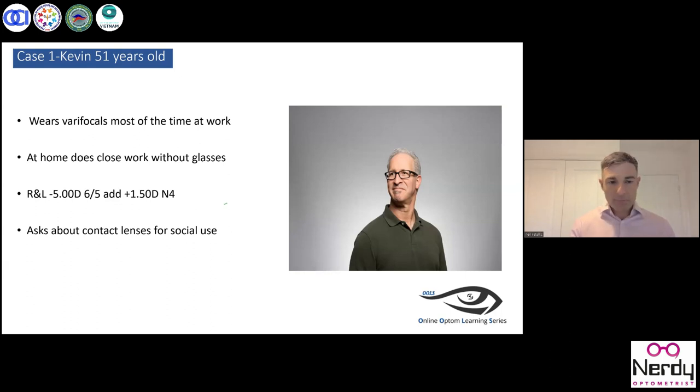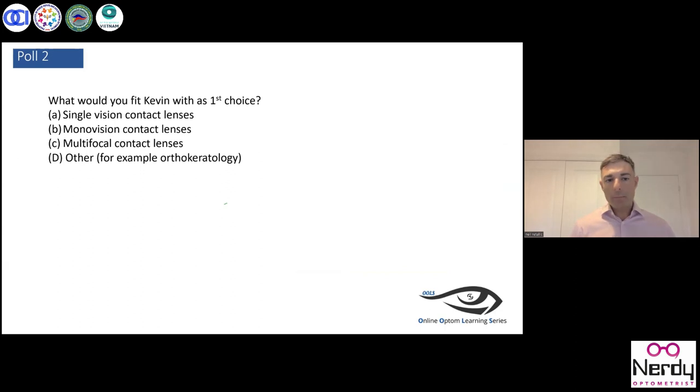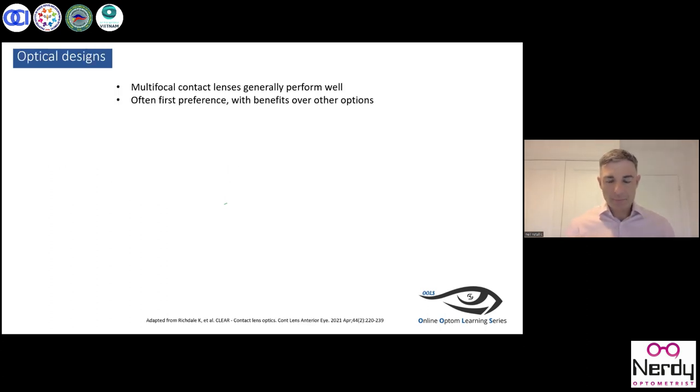So I'll go back to another poll, if that's okay with you guys. And I'll ask you, what will be your first fitting choice for Kevin? And I appreciate there might be more information you might use to make that decision, but are you more likely to go single vision contact lenses and then build him up? Would you go multifocal? Would you go for monovision? Or would you go for another lens such as orthokeratology? So almost 75% of them would want to suggest multifocals. Then you have about 15-17% monovision, and a couple of them are also interested to suggest single vision contact lenses as well.